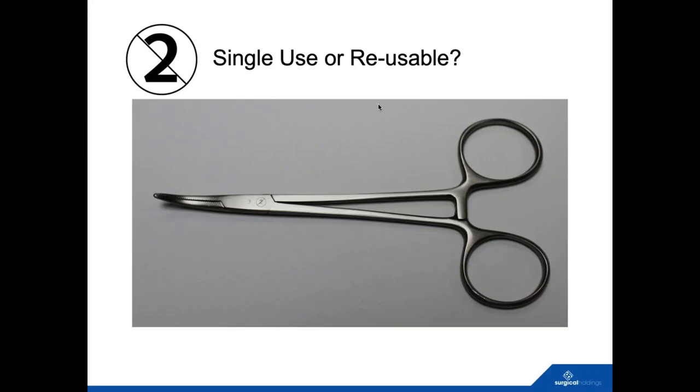And we're seeing more space for single-use devices, I think where it might practically make sense. So things like suction tubes that maybe are difficult to clean, or very delicate devices that, if you don't clean them while you're protecting them, can become damaged very easily. So single-use obviously has a good use in that respect. But certainly not reprocessing. We'd hope you wouldn't see any instruments on your trays that would have this symbol on them.